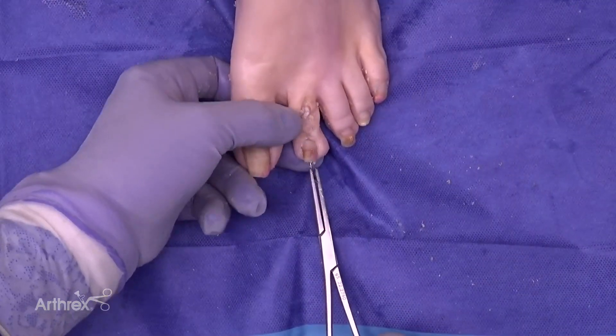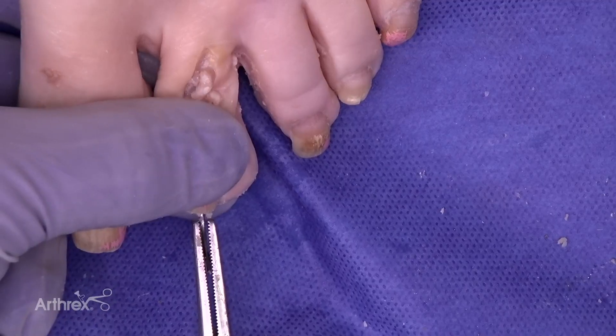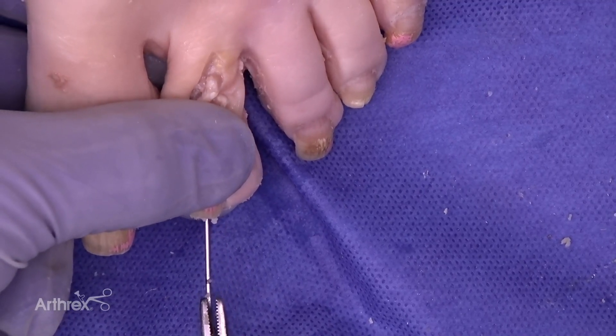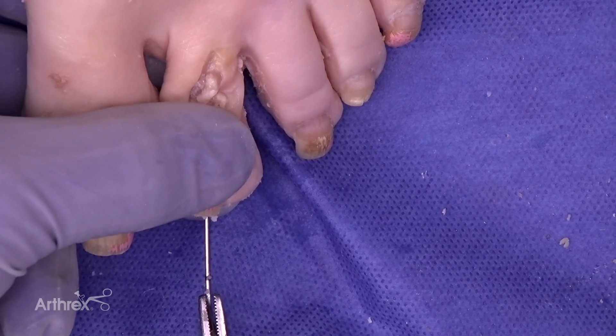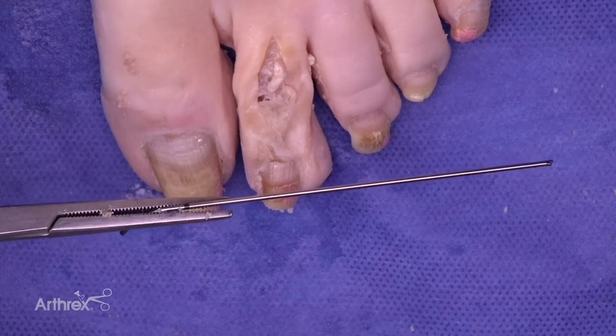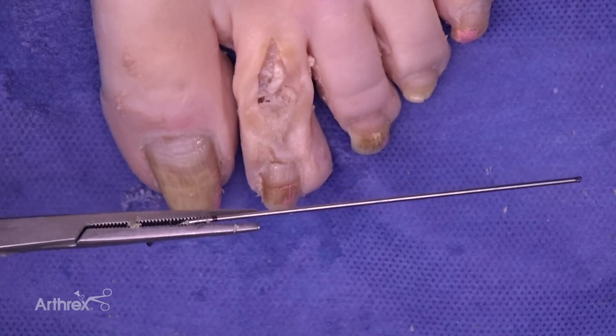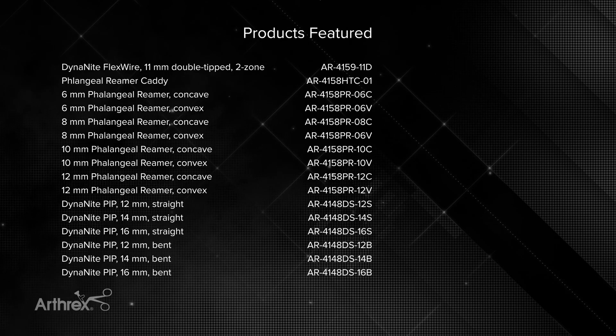When removing the wire in the clinic, all we need to do is clamp it as we normally would and pull it straight out. We will be able to see that the wire is straight as opposed to being bent, even though we manipulated the second metatarsal phalangeal joint. This minimizes the risk of having to remove bent or broken wires, which is a significant advantage in this procedure.